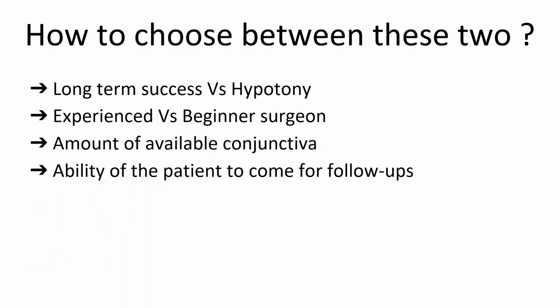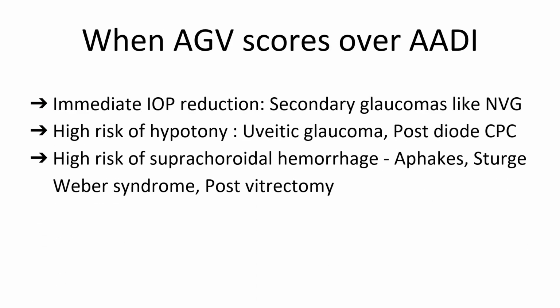If so, how do we choose the one for our patients? It depends on the type of glaucoma, the condition of the eye preoperatively, and the experience of the surgeon. There are, however, certain indications when a valved implant is better than a non-valved one.